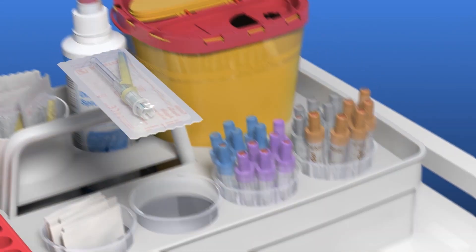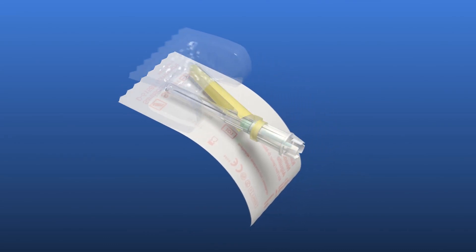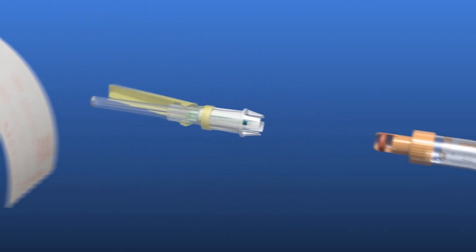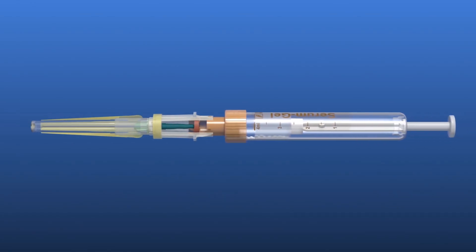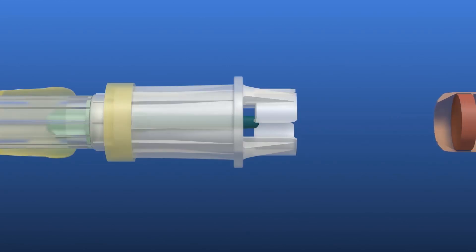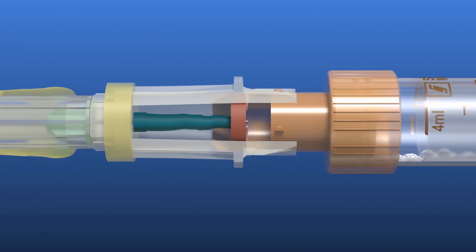Remove the safety needle from the packaging. Thanks to the peel-off opening, this can be done without having to touch the safety needle. Connect the first S-Monovette to the safety needle by sliding the S-Monovette into the integrated holder and turning it clockwise.